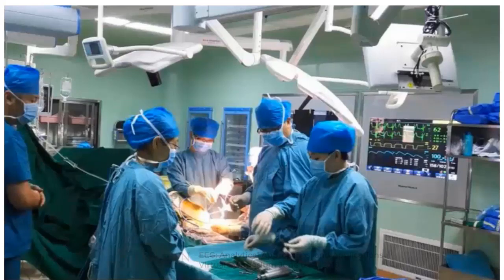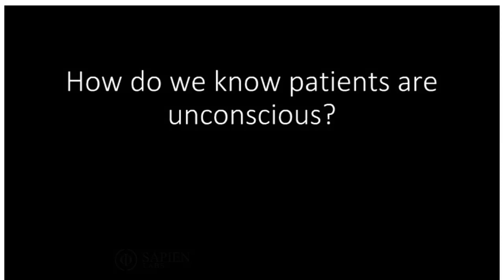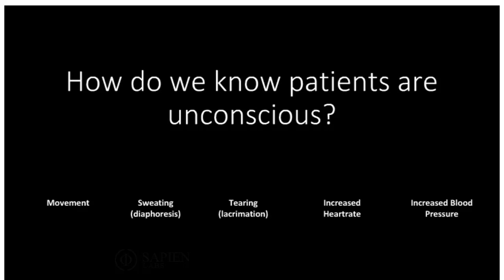And we're able to monitor this with things like heart rate and blood pressure, but we're still operating under these assumptions. And for the most part, this is true, and anesthesia and surgery are carried out with only benefit to the patient. But the question remains, which is, how do we know patients are unconscious during their procedures? So most anesthesiologists today use one of 5 signs that the patients are experiencing inadequate anesthesia. So they look at the patient if they move, they look if the patient has sweating or tearing, and then with their cardiac monitoring equipment, they look if their patients have increased heart rate or blood pressure with surgical stimulation. And they use these signs along with patients' other vital signs to titrate their level of anesthesia.